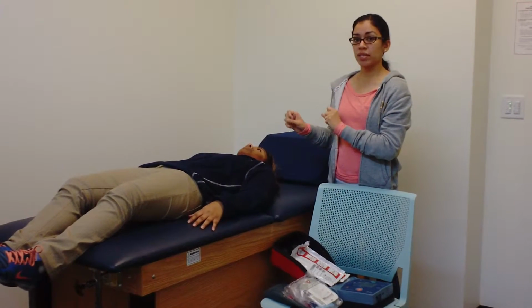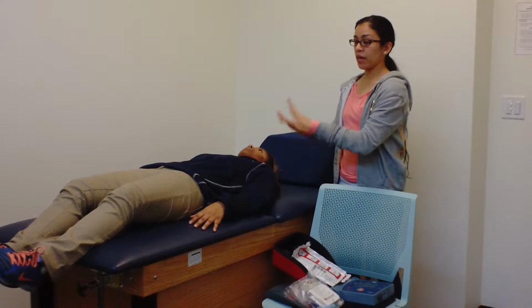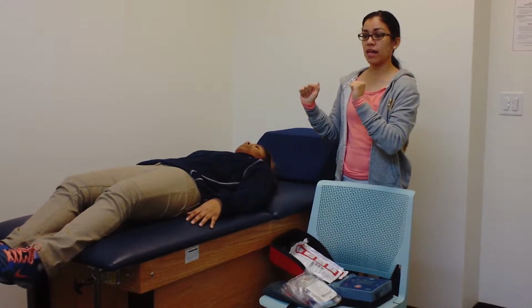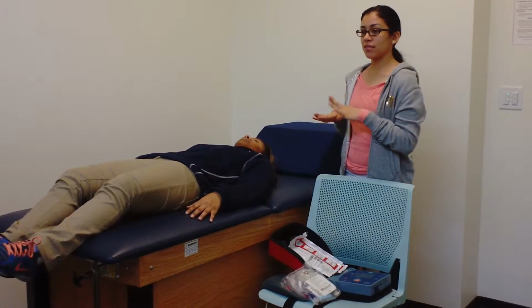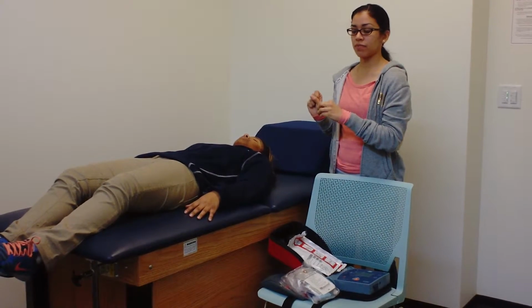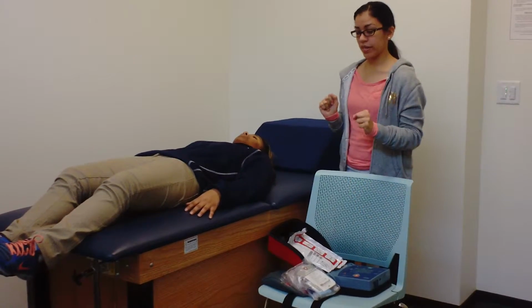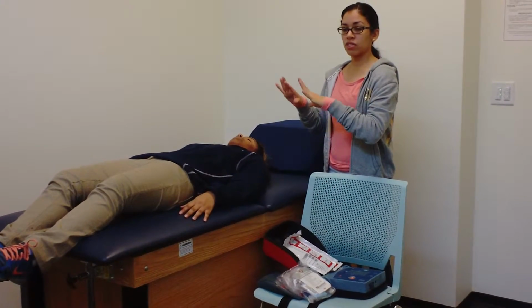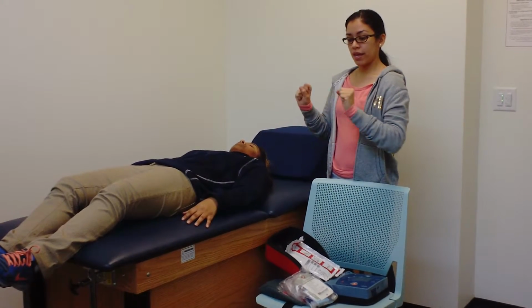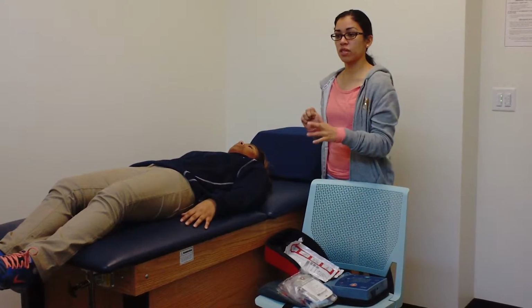I would do about 2 minutes of it, and again, analyze the heart rhythm. I'm not going to touch the patient. I'm going to tell everybody to stand clear. I'm going to press the analyze button, and it's going to analyze the heart rhythm again. If a shock is recommended again, I would press the shock button, and then the shock will be delivered. And once the shock has been delivered, it'll stop, and I'm going to again proceed with ABCs.